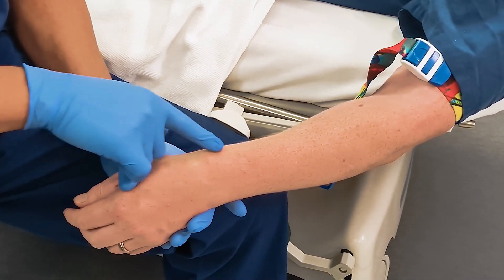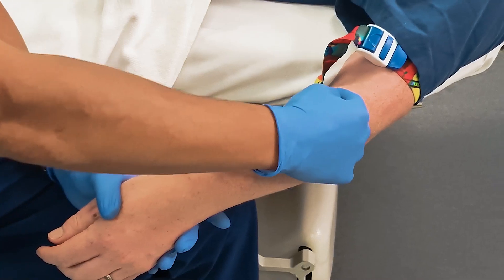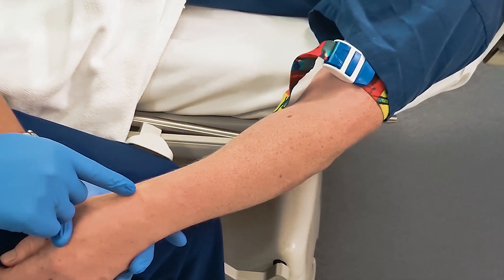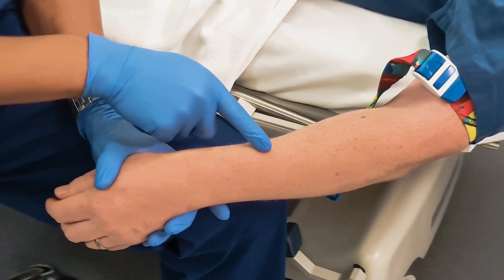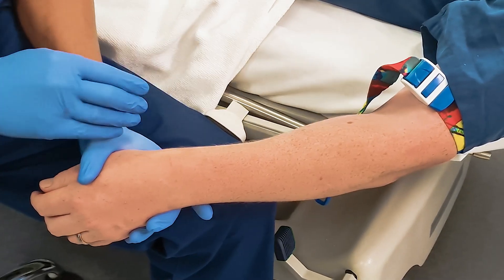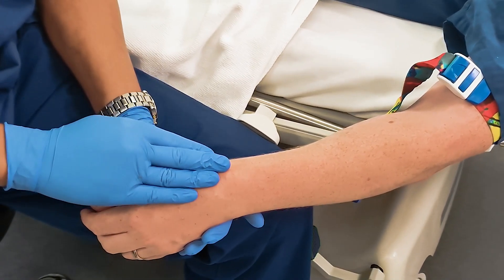That would limit the options for future cannulation along that segment. Whereas if I went more distally, even if I missed, I'd still have each of those other points of insertion available. So I'd always say go from the most distal site that still satisfies the purpose.